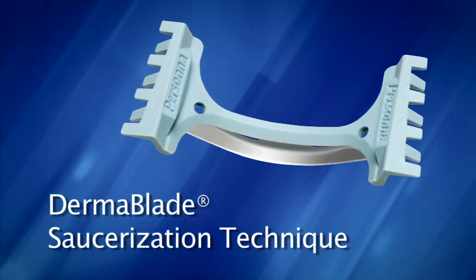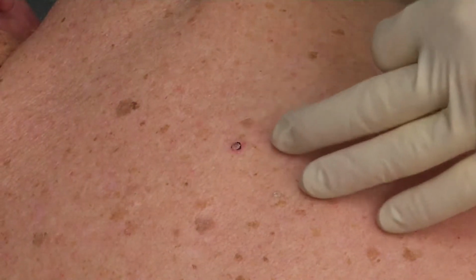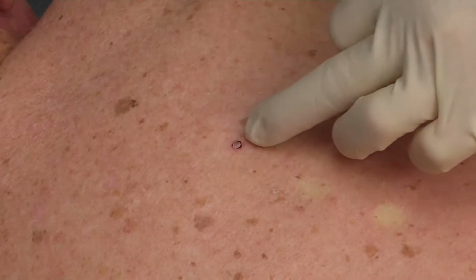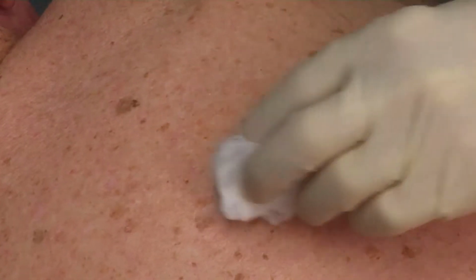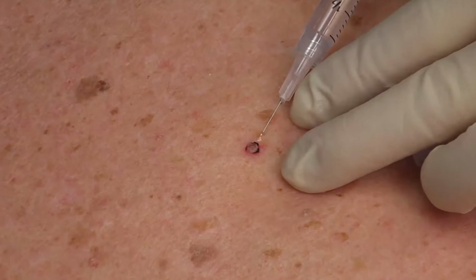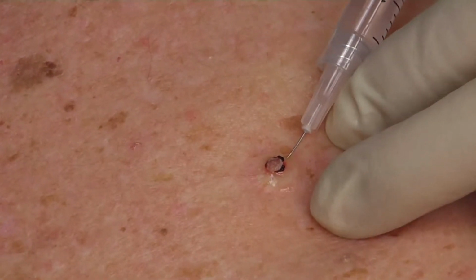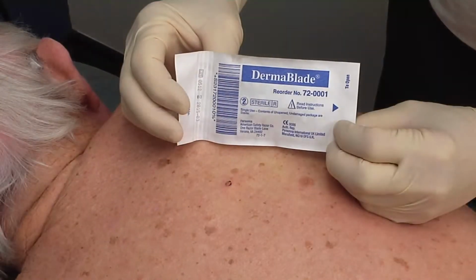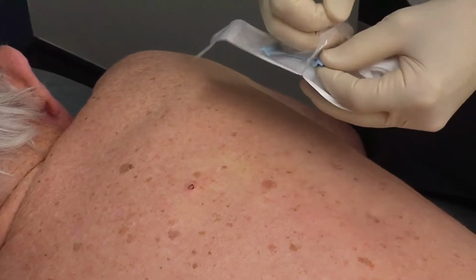We're going to demonstrate the use of DermaBlade to biopsy an irritated keratosis that may be a squamous cell, maybe a seborrheic keratosis. It's got a little bloody crust around it. So I'll clean it with alcohol and a gauze, numb this up with a tiny shot of xylocaine with epinephrine that's been buffered. That'll give instant anesthesia with that high intradermal technique to raise a wheal. And then the DermaBlade here is sterile for one-time use.